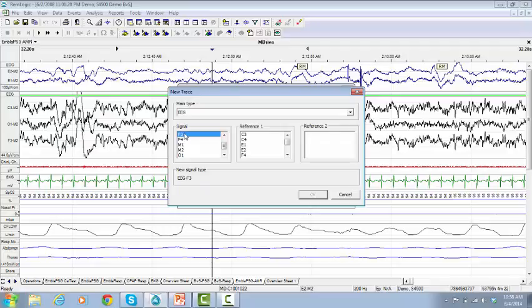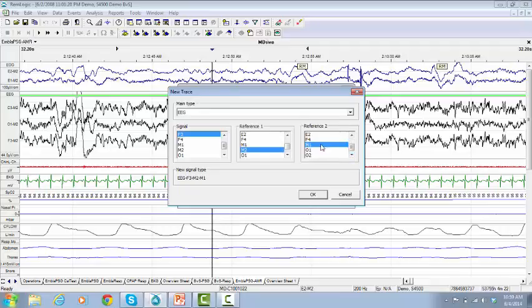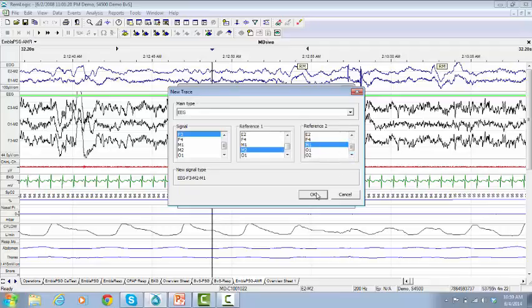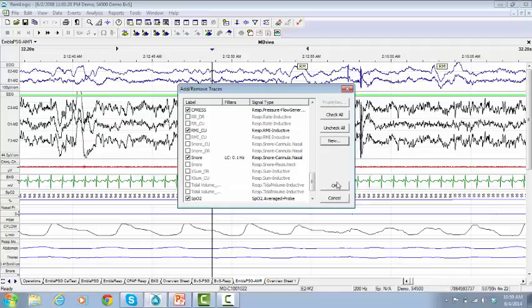Select Reference 1 and Reference 2. Click OK, then click OK again.